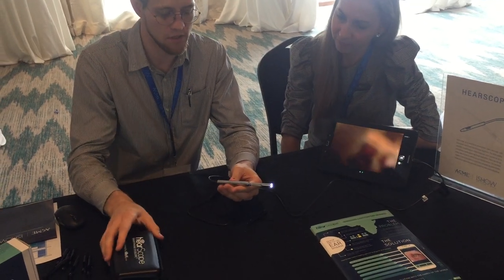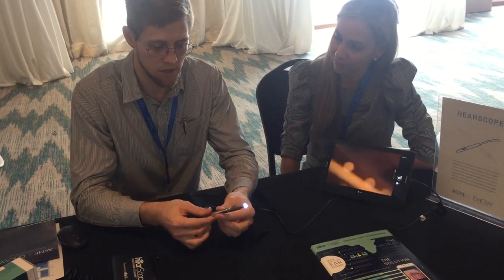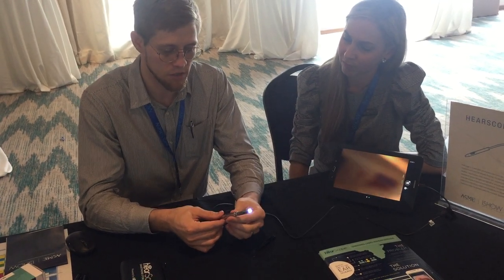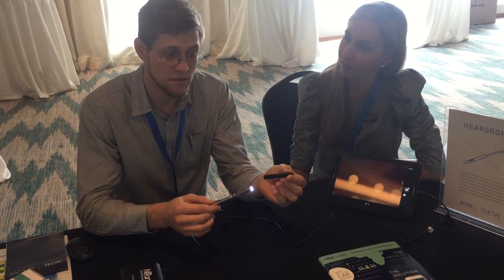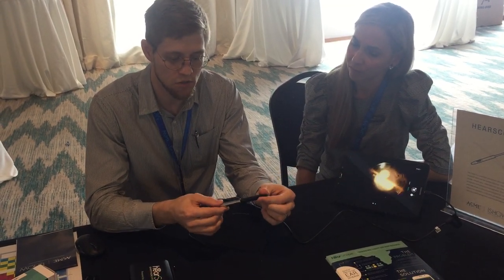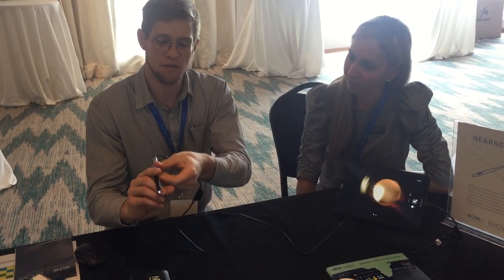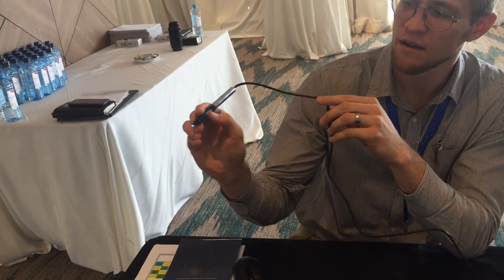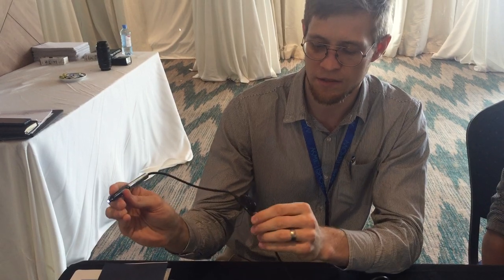Some cool features: it's got variable light intensity — you can change the light by turning that little knob. It's got variable focus so you can zoom in and out to the correct focal plane, and quite a high magnification. These plastic speculars easily clip on to the device, and if you're left-handed or right-handed you can just turn it around. You turn the focus to move the focal plane in and out, and turn the other dial for LED intensity.